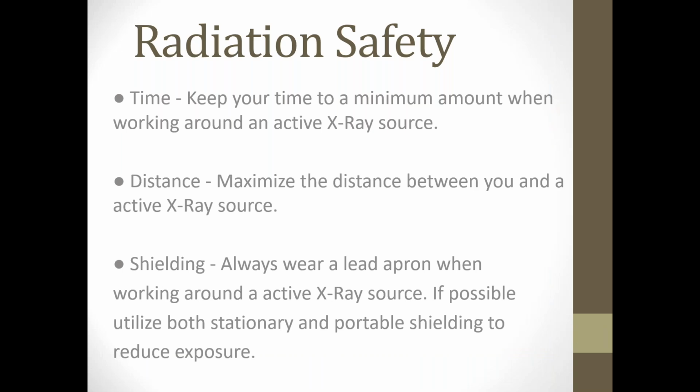And then, just covering radiation safety, keep your time as minimal as you can around the X-ray, keep your distance from the X-ray, and whenever possible, use shielding, lead aprons, and other protective equipment to reduce your exposure to the X-ray.